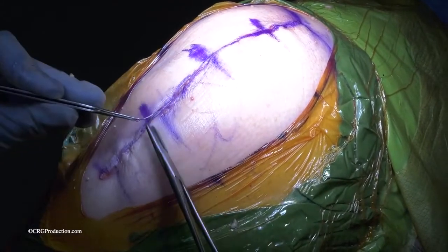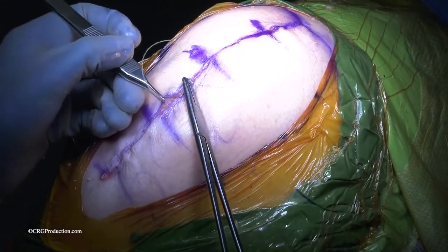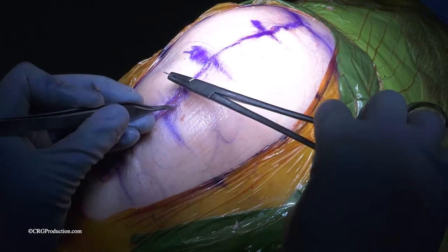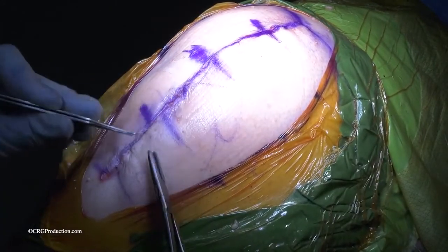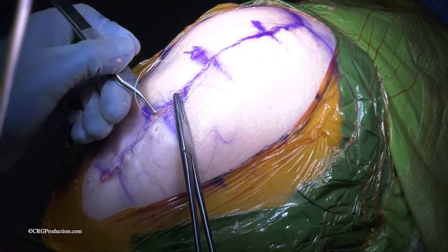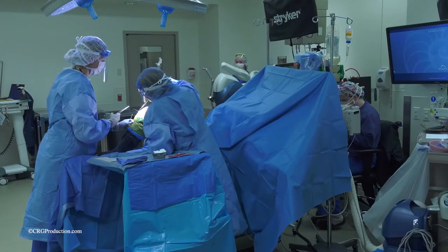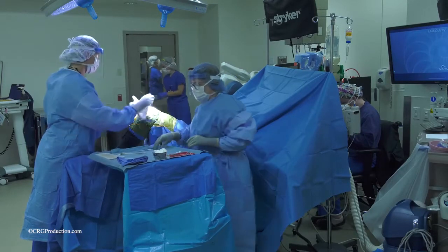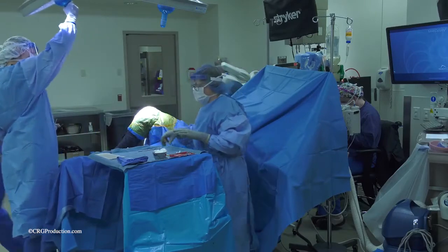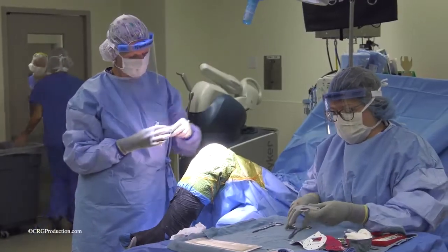The use of the pins and the pins array within the incision is an off-label use, but we found that it works and should be okayed by the various licensing agencies. We can see that the PA is doing an excellent job on the subcutaneous tissue. You may notice that we keep the knee flexed and bent in 90 degrees of flexion. This is to decrease the chances of having a stiff knee after the operation. This seems to be of definite benefit for the patient.